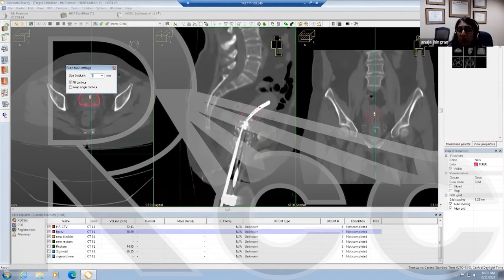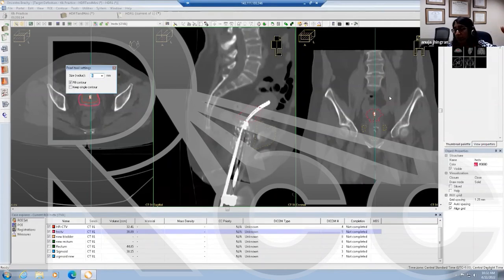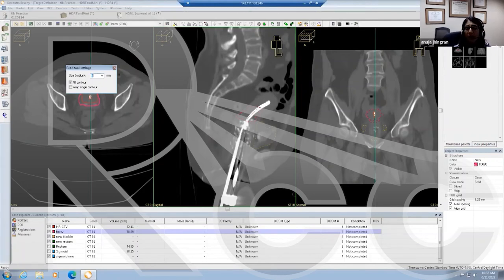How superior do you go with stage 3–4 disease extending superiorly into the uterus? Your HR-CTV is going to be however much disease you have — if it extends further than 3 cm into the uterus, you contour the HR-CTV to go further than 3 cm. In this case there was no disease going into the uterus. For an inoperable endometrial cancer, you'd contour the entire uterus and treat the entire uterus to the full dose.